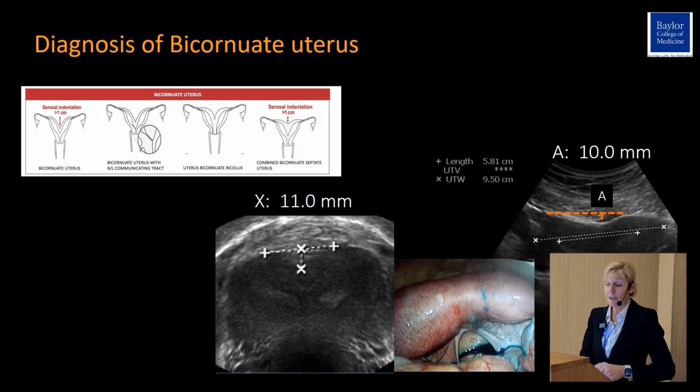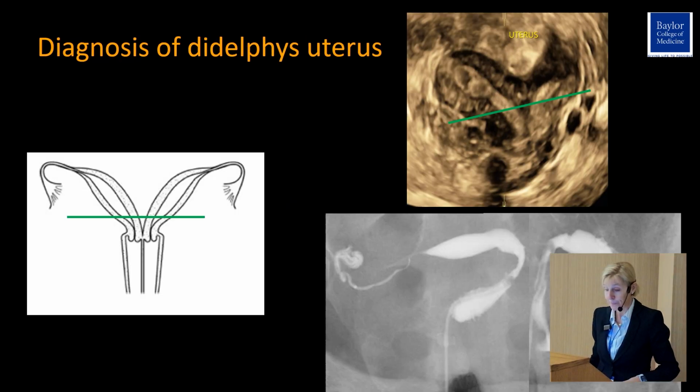Again, surgery is our quality assurance to make sure that we performed the diagnosis correctly. However, there's very little to add to the 3D ultrasound diagnosis, as you can see.